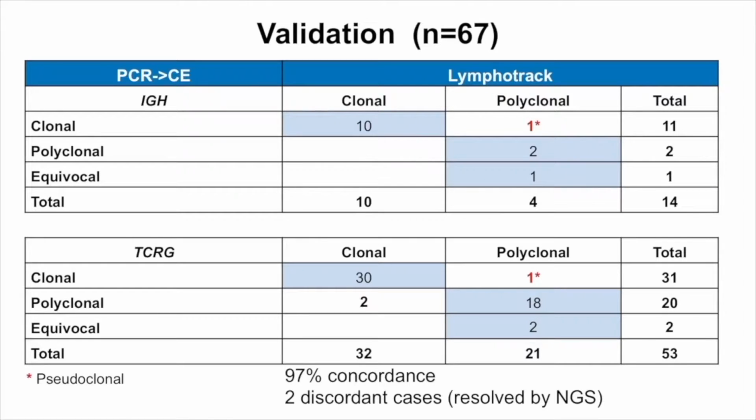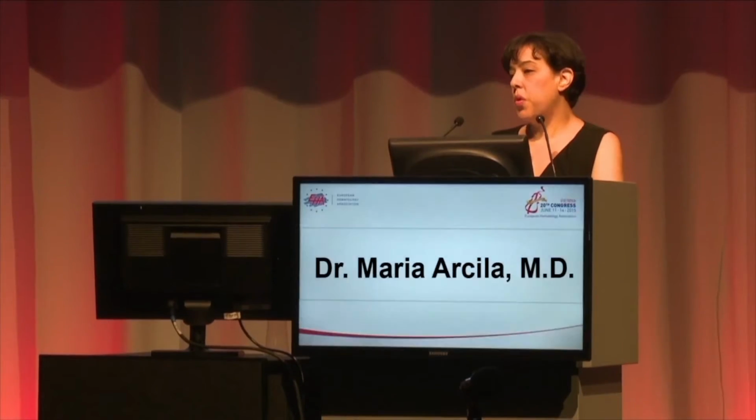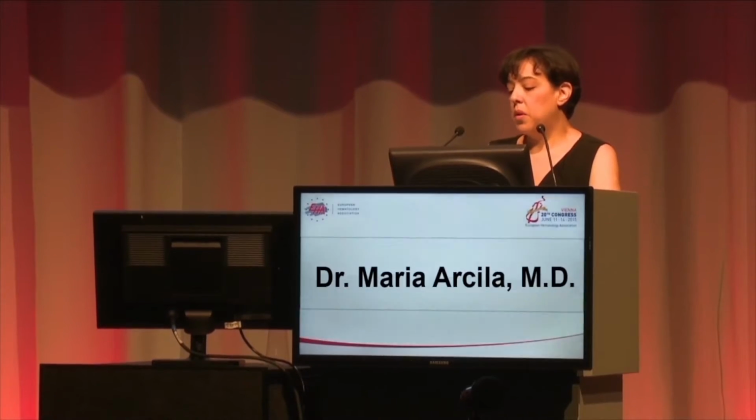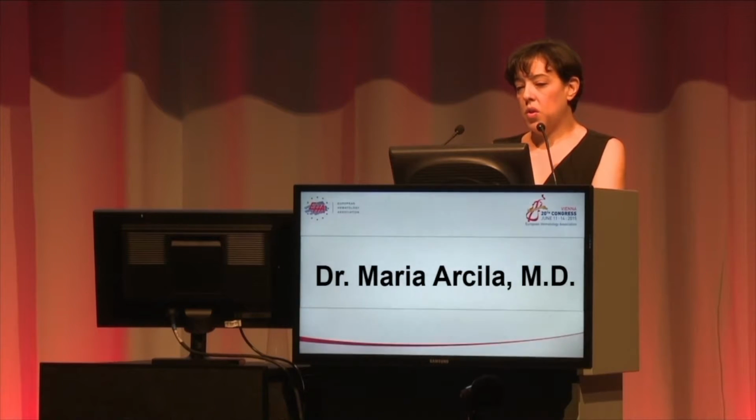And the discordant cases were cases where the NGS assay resolved clonality calls, where we had made a call of clonality that was actually a pseudoclone. So we were able to resolve some of those calls with this new assay because it gives you so much more information for each individual clone that you have, and also the usage.